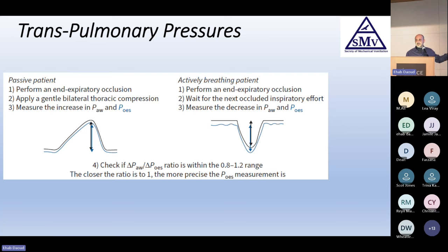So sometimes it takes a lot of work and those balloons deflate. Sometimes you have to keep deflating. If the patient is actively breathing and sucking in, so you put an expiratory pause, the patient sucks against the closed valve, causing this airway pressure, and the esophageal pressure should again mirror it.